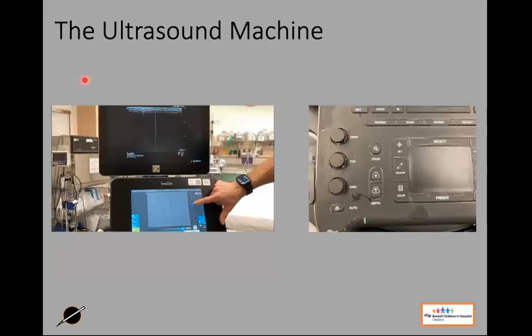Okay, some of the buttons that come with our ultrasound machines, and again, we've got two different types. So the nice big one here, our gain, which controls the brightness of our screen. Up here, the brightness of our image is down here along that bottom axis, and it's a slider button. We'll move it right or left, and that'll adjust the brightness. On our smaller, older machine, there's a knob here that says gain. It's indicated by that orange marker right there. That's the knob we're going to be rotating to adjust the gain on our smaller machine.